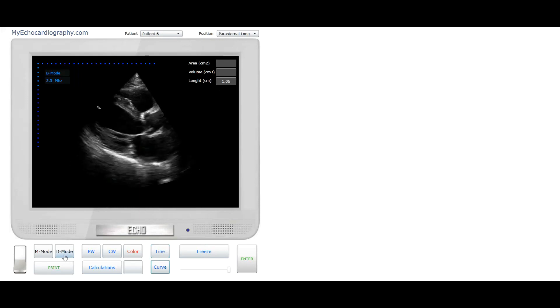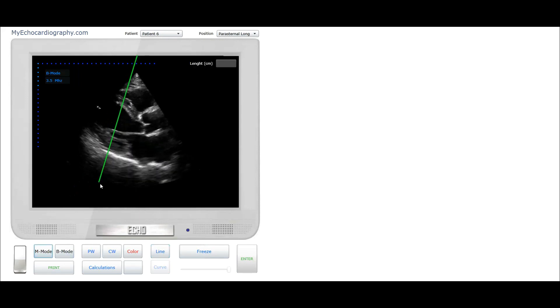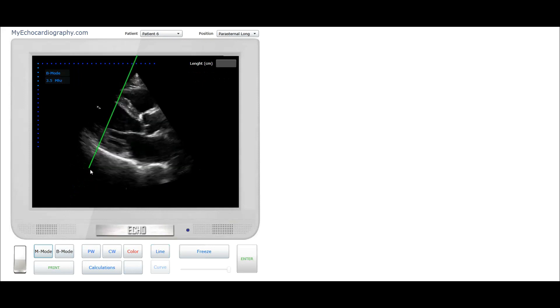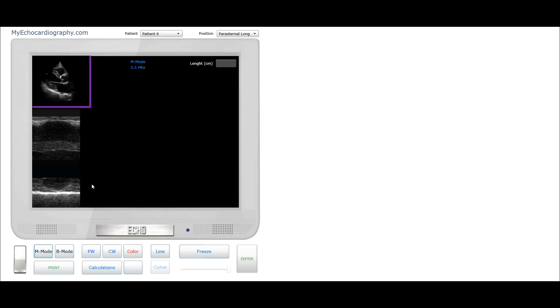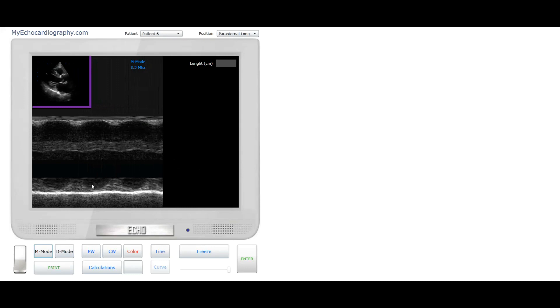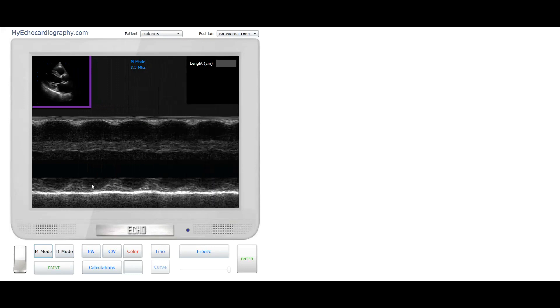We use the Parasternal Long Axis View for one-dimensional measurements. Click the button M-Mode and place the cursor to cross the left ventricle. In the one-dimensional diagram of the left ventricle we can perform linear measurements, for example thickness of the interventricular septum or short axis of the left ventricle.